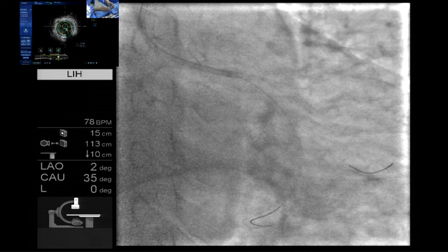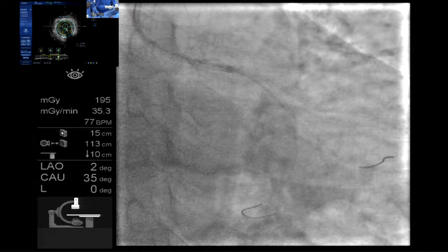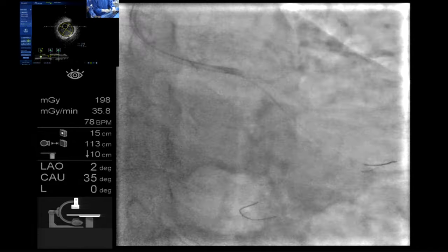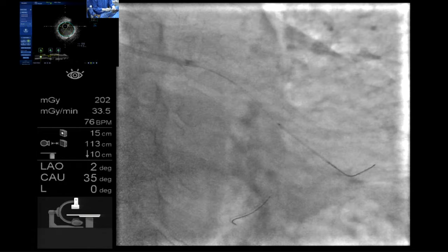When you look at the lifetime management, would a long stent into that circumflex, I mean, that OM, be a good strategy? It's not that long, no? 24 is not that long. Would there be a place left for a future bypass in that region? I think the goal is a long-term result. Hopefully, the patient does not need bypass or further intervention. From all the DK crush data, especially the big vessel, the failure rate is quite low, 5%. So even though we put one stent in the OM, 24, you still have room for bypass and you don't think it's a problem.